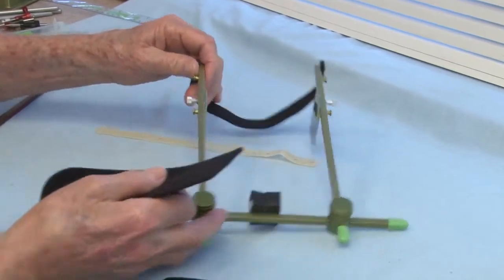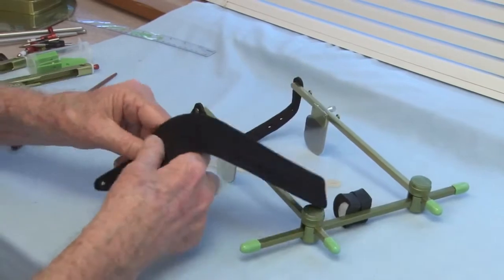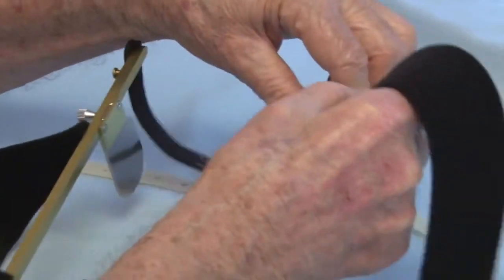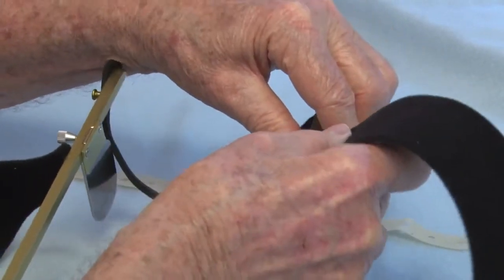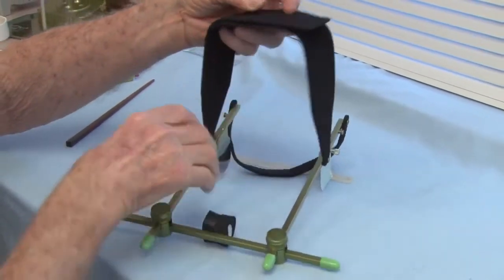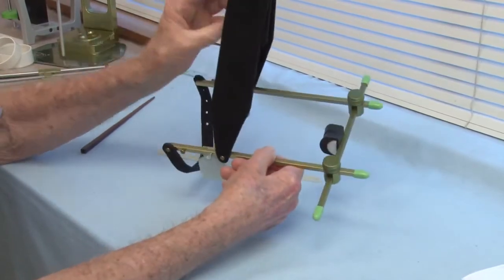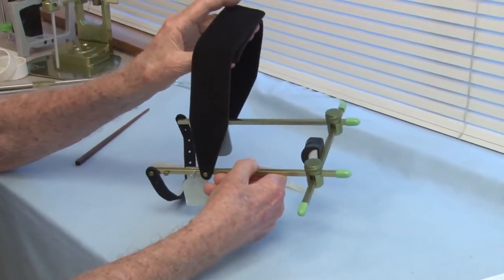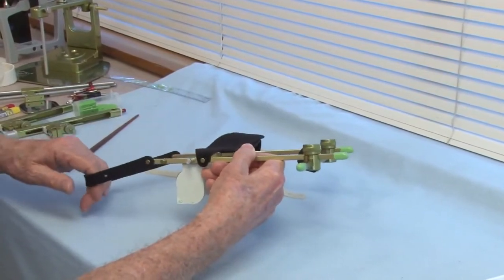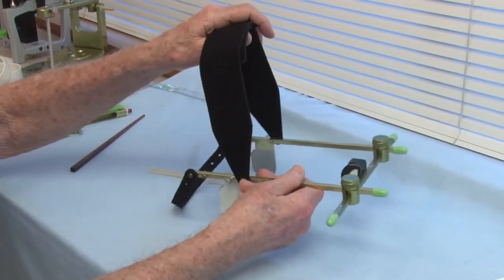The Velcro strap, you have 2 places depending on the size of the head where you hook the Velcro strap. And so we could hook one here, one on the opposite side, and then they would go up over the patient's head, and that then supports the vertical position of the flag assembly. So you have the Velcro straps holding it in this vertical position like this. This is a rubber band holding it in an anterior posterior position. And this is where you would set up your flag assembly on the patient.